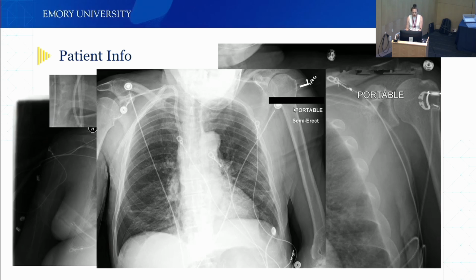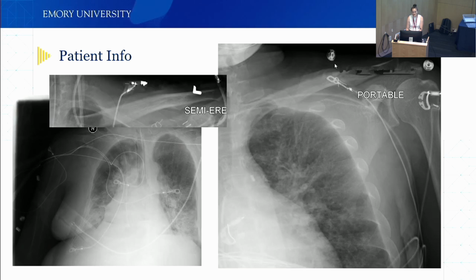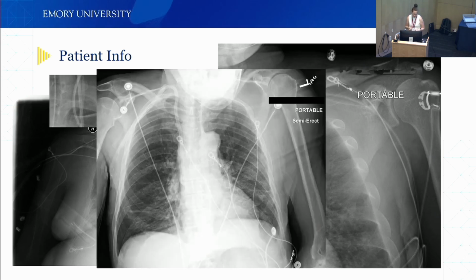So it is important to know, hey, did somebody do this? Was it done on all X-rays? How did they do it? Do we have to recreate this on different X-rays when we merge data sets?